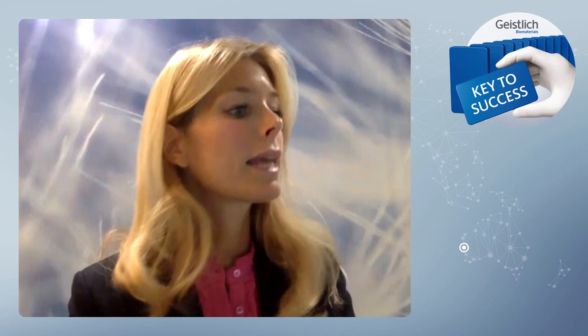Can an implant be used as the tenting screw in vertical augmentation? Absolutely, yes. You can use the implants together with the vertical augmentation. One recommendation, obviously, the implants have to be positioned in the perfect prosthetic position. So if you have enough bone to stabilize them, then absolutely yes.